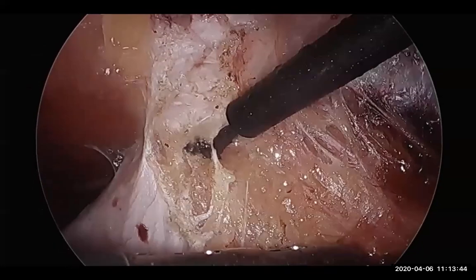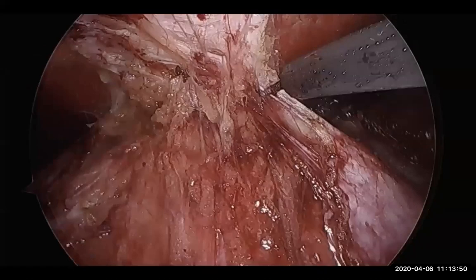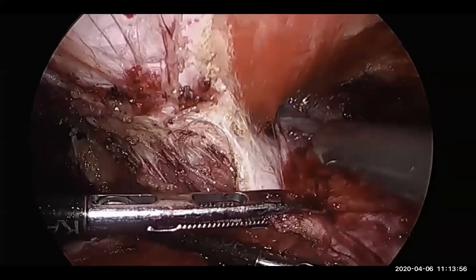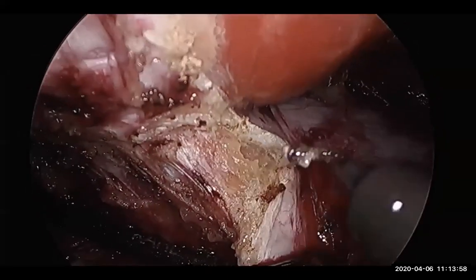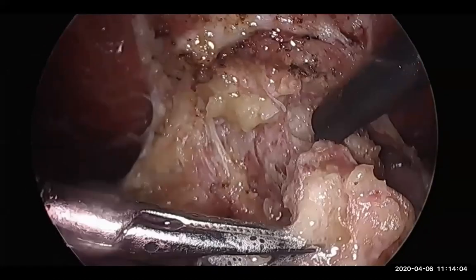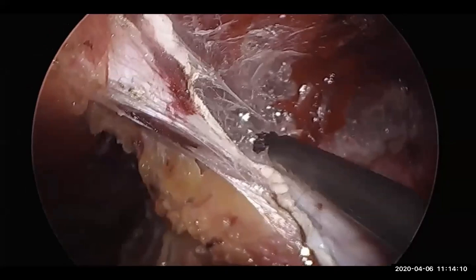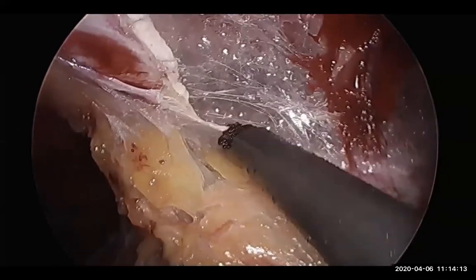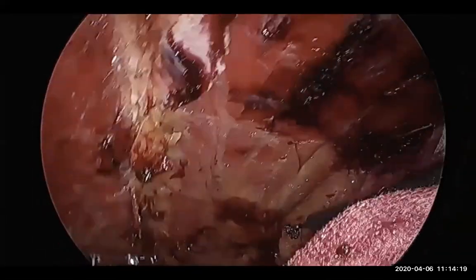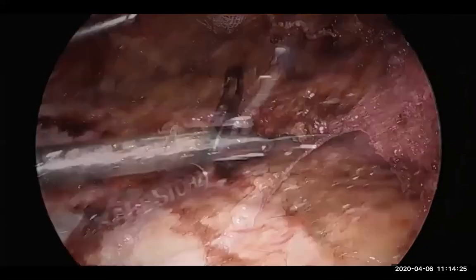So the hook gives you very, very precise lines of division, and now you can see more and more space is available for the surgeon as you continue the same process of dividing the posterior rectus sheath till you reach the hernias. Often you get more than one hernia, and you just keep pulling the contents down and dividing these vascular strands on either retrorectus compartments. And very soon you see that your pelvis is connected to the bilateral retrorectus compartment.